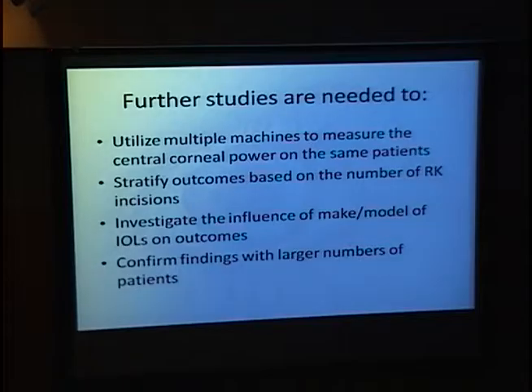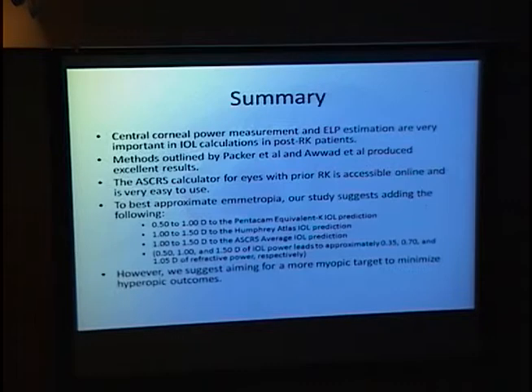So further studies are obviously needed to use multiple machines to measure the central corneal power on the same patients, and stratify outcomes based on the number of RK incisions. We tried to do that. We didn't have the number of patients necessary to do that. Different IOLs are used that could possibly affect outcomes, and we need to confirm findings with larger numbers of patients.